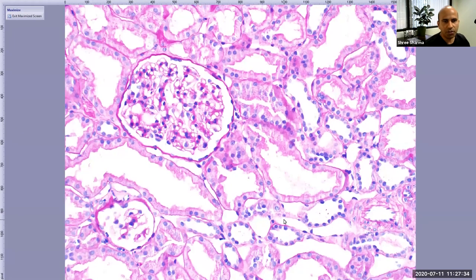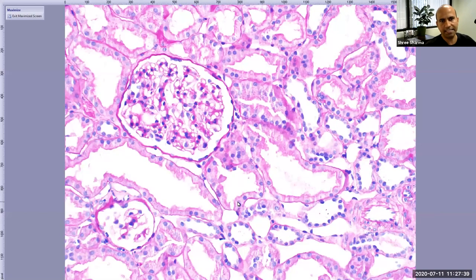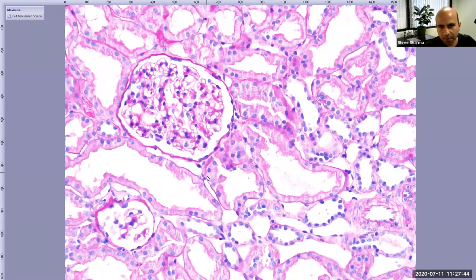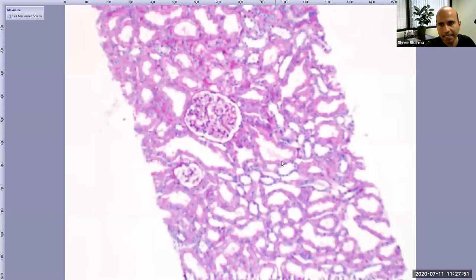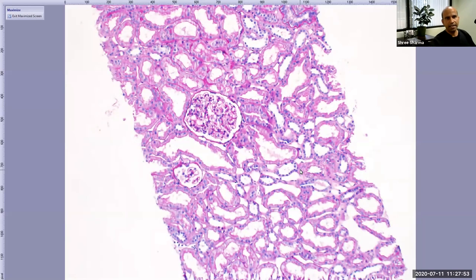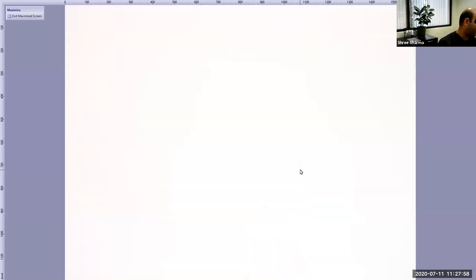On PAS stain: brush border is visible, the mesangial matrix is much more pink, basement membranes are very obvious, and you can see the clear definition of tubule boundaries and the boundary of the glomerulus. I'll show you the same field on an H&E stain so you will be able to see the difference.